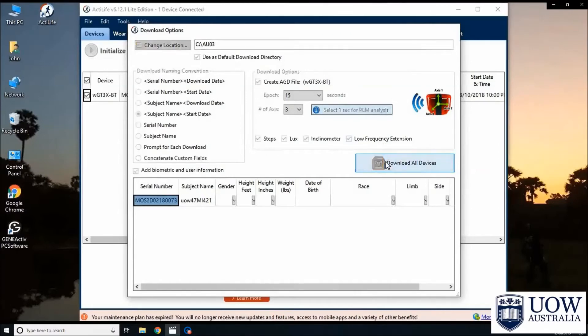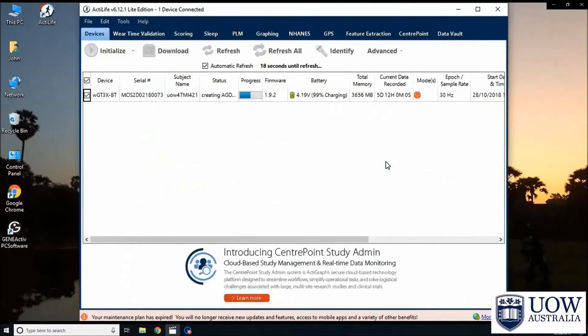Lastly, click on the download all devices button. This will close the window and return to the main software window.